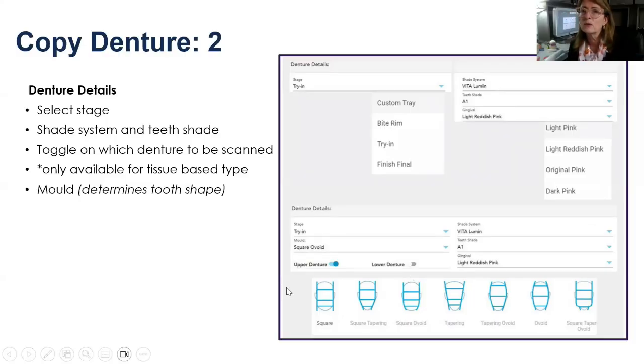There is a really cool mold guide, if you will, that auto-populates, and it is based off of Dentsply Sirona's original theory of taking the patient's shape of their face and inverting that, and that is supposedly the shape of the central.